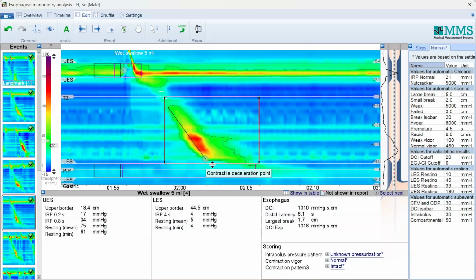Okay. So if it is below 4.5, what does it mean? Suppose it is here, that means it's going in this direction. That means it is very quick, and that means there is spasm.